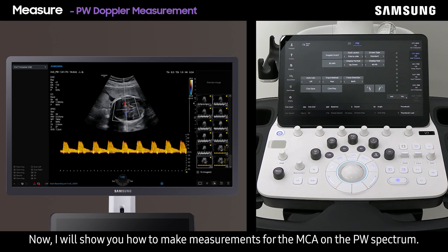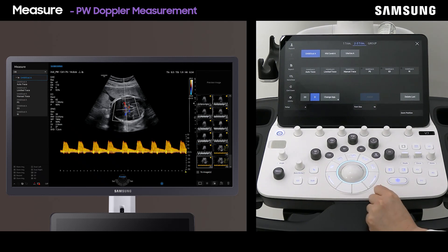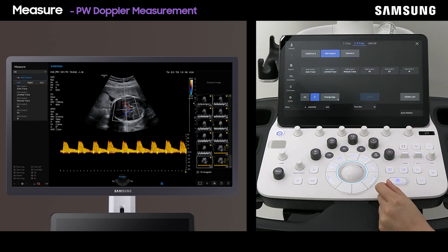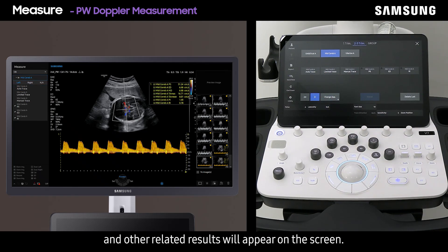Now I will show you how to make measurements for the MCA on the PW spectrum. First press the measure button, then select MCA on the touch screen, and press auto trace. The system will automatically measure the entire spectrum and other related results will appear on the screen.